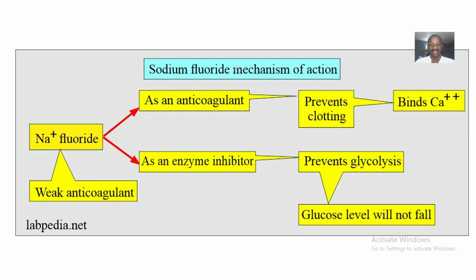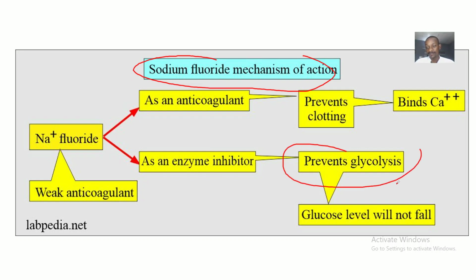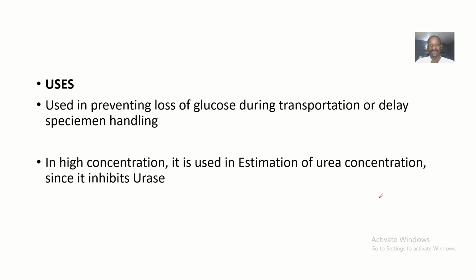You can see the mechanism of sodium fluoride, basically to prevent glycolysis, all right? And glucose levels will not fall, all right? So to preserve the glucose content of a sample, all right?